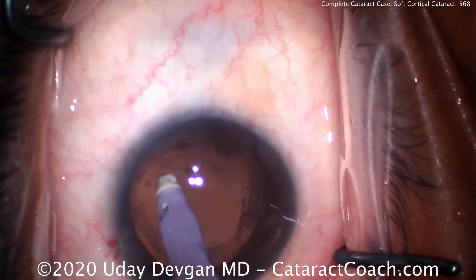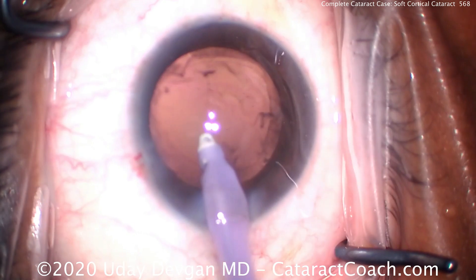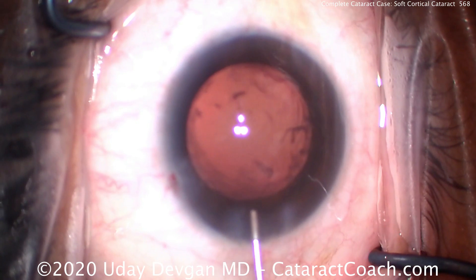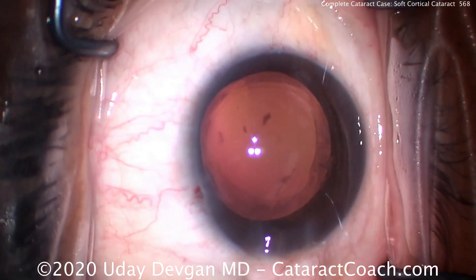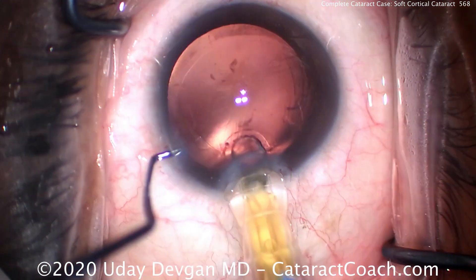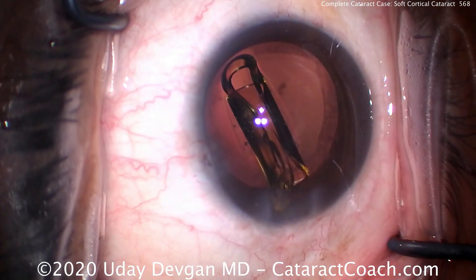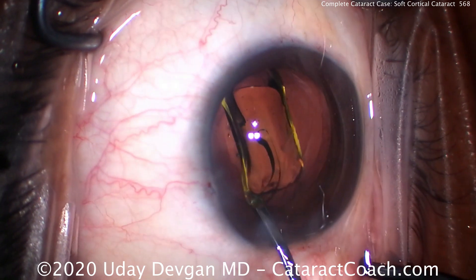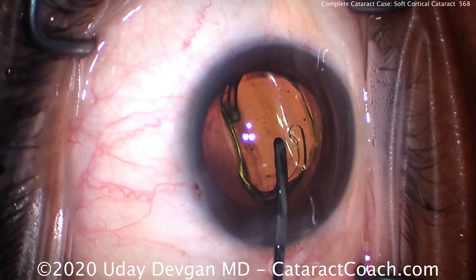The important differentiators in this type of cataract: number one, the patients tend to be younger — that's important for setting appropriate expectations. If this patient were 40 years old, you have to explain that the new IOL will not have accommodation and they will lose accommodation. Number two, because of the cortical opacity, the capsulorhexis is going to be more difficult to see. Don't let go of the capsulorhexis edge unless you can already see it, or use trypan blue dye to help with visualization.